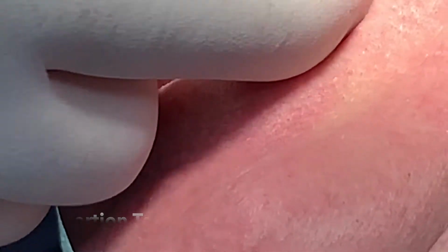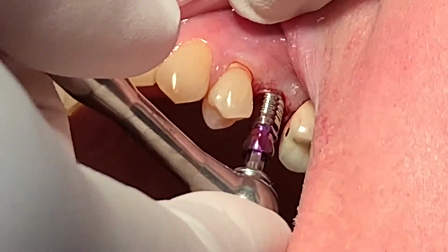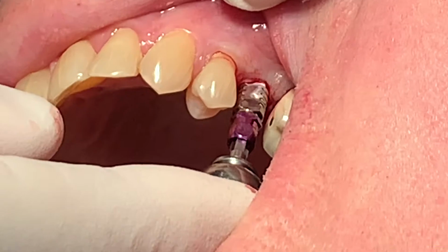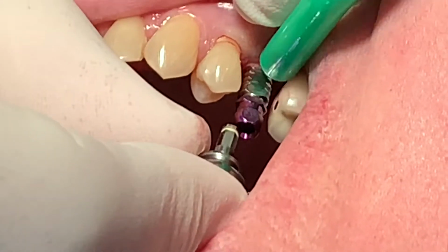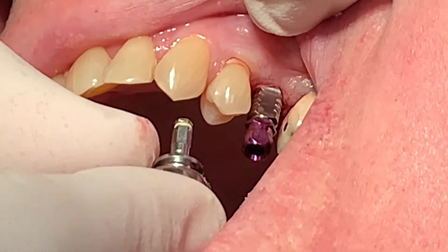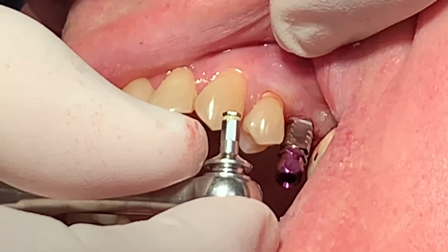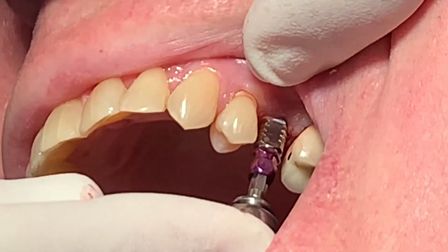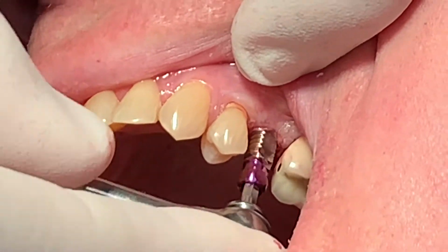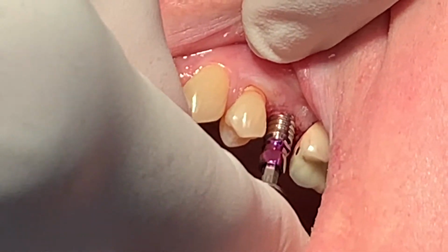Put your finger, yeah, that's right. Ratcheting it in. I'm going to let that sit for a couple minutes just to decrease the amount of torque. Let's go ahead and take an x-ray there and see how we look. Doc, what do you think? You want a little lower? Yeah, go lower. All right, I'm going to go lower per Dr. Nisnik's request. And I'm going to stop here.